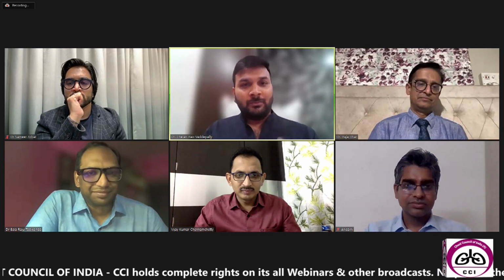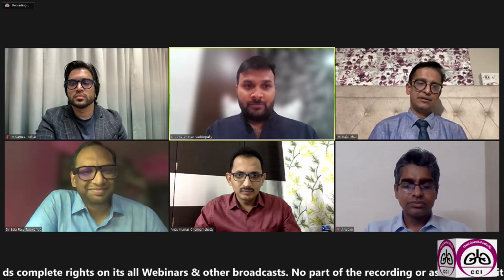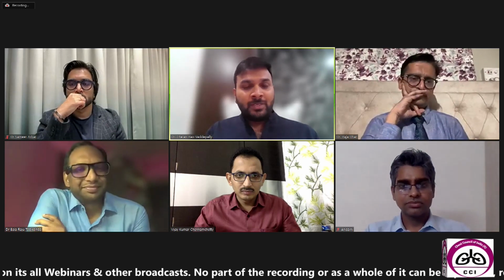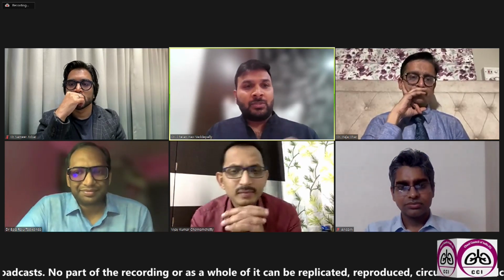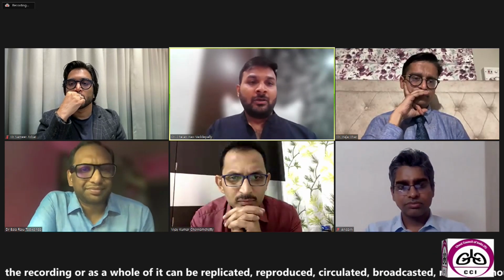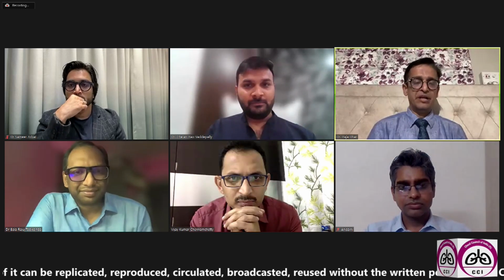Whenever we talk about cryo, the balloon also holds equal importance, be it a Fogarty balloon or an endobronchial balloon, and they are equally notorious. We have seen balloons rupturing inside, leading to catastrophes. So I would suggest always being ready with a second backup option. In our case, we are always ready with the DLT tube, or we do a barrel-in-barrel intubation with a rigid bronchoscope and do isolated ventilation. This came from experience. So the balloon has its place in cryo. Yeah, absolutely. Brilliant point, Chetan.